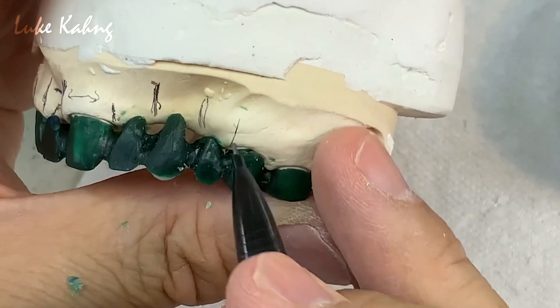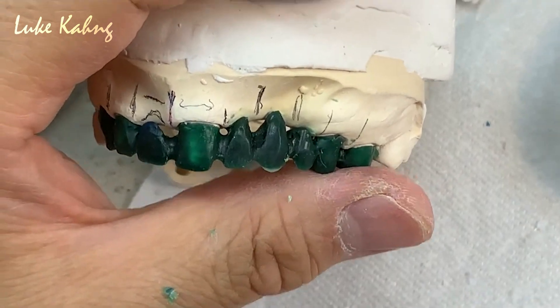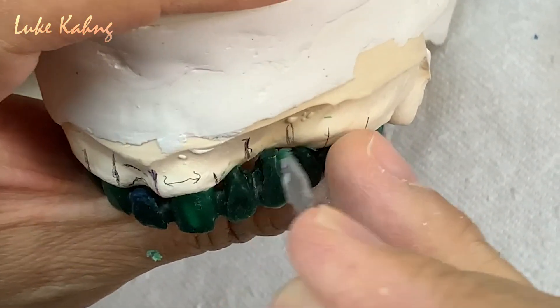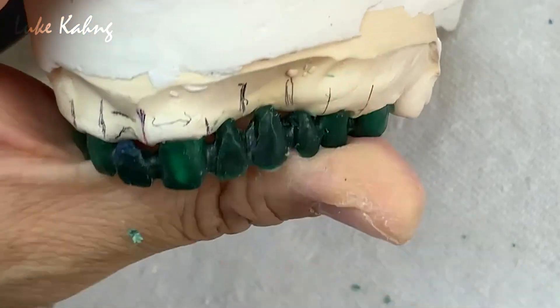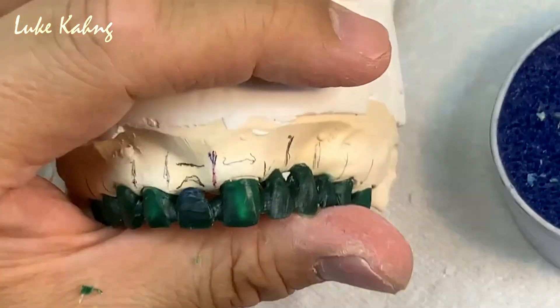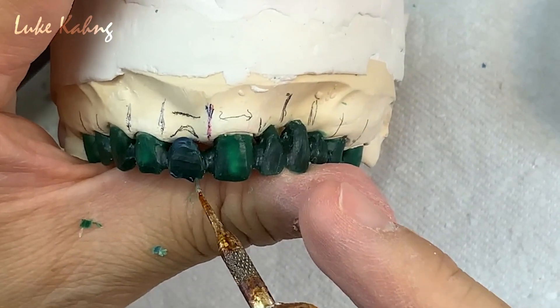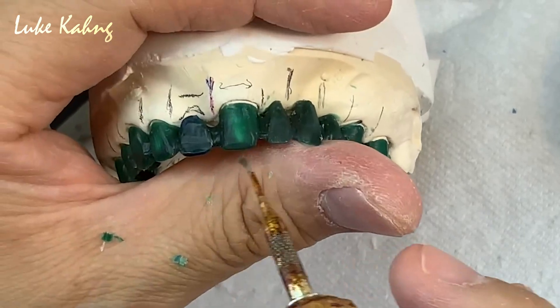Move on to canine to premolar — that's the size I can build up. You see the deep niche — I think this is too long, so I have to cut it. I don't need that much, so I cut that area.